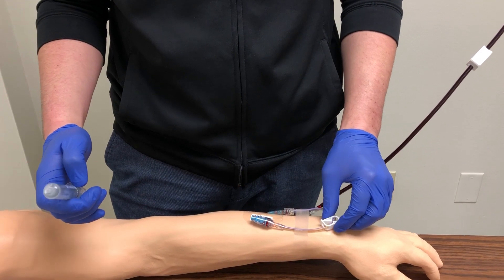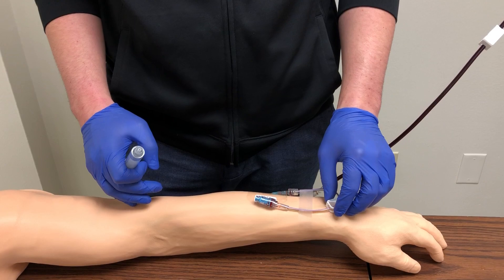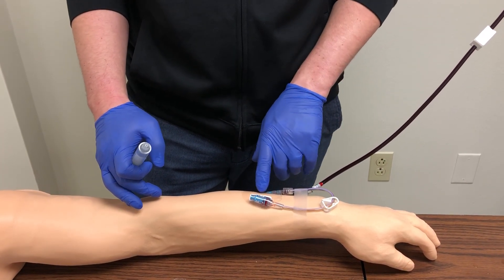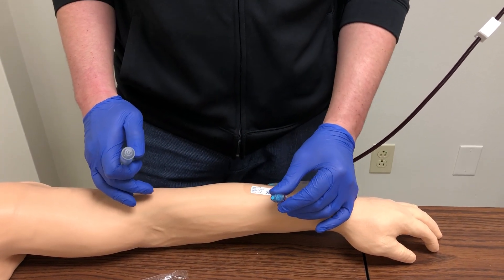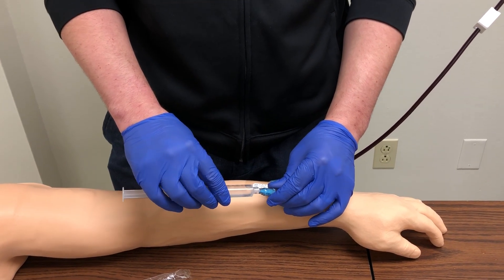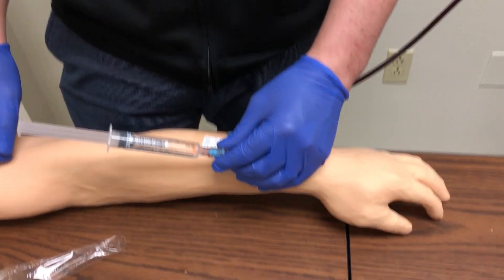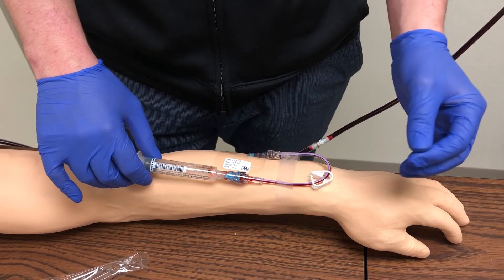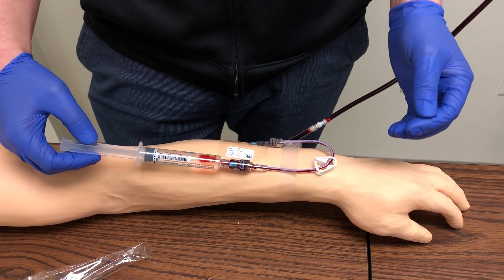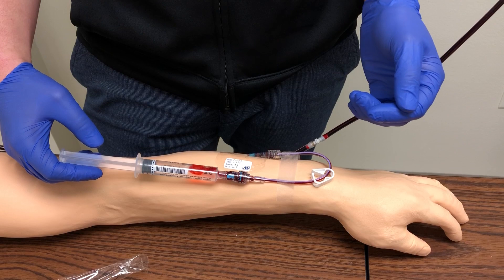First thing you want to do is make sure that the J-loop is unclamped. You want to keep it clamped when not in use to prevent any back flow of blood that could cause thrombus formation at the tip of the catheter. Hold the injection cap in your non-dominant hand and connect your saline flush — it takes a little pressure, twist to the right. This is a needleless system called a LUR lock. Once connected, pull back on the saline flush to check for blood return, which confirms placement of the IV catheter inside the vein.